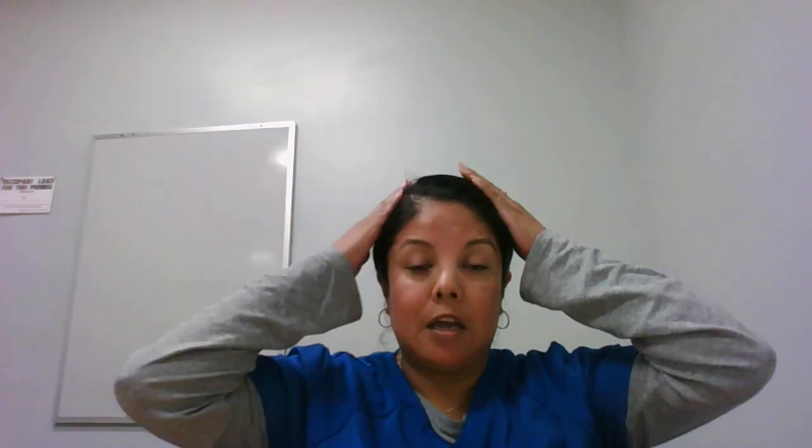Question number one says: list and talk about the items you would check yourself for, remove, and lock up before entering zone 4. So basically, I will demagnetize. I will self check from the top of my head all the way down my entire body to make sure I don't have anything ferrous on me.